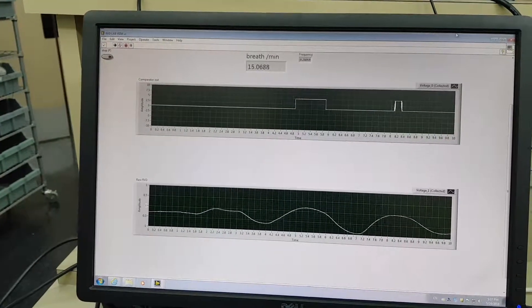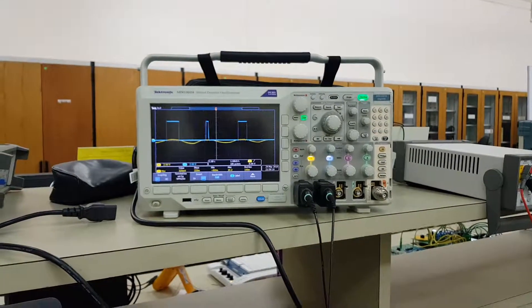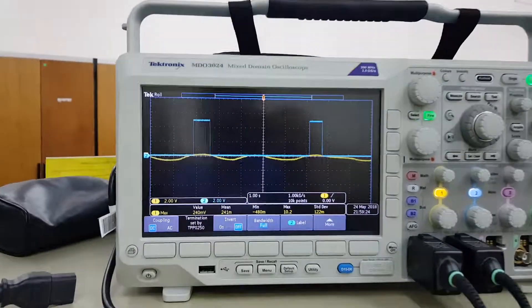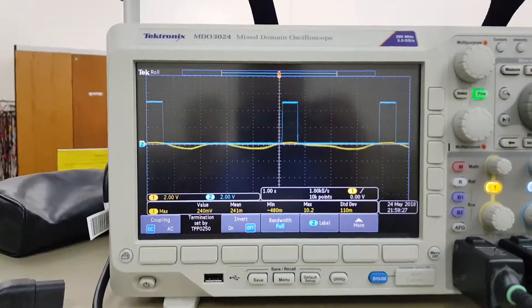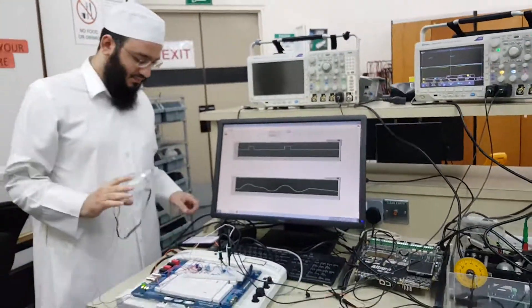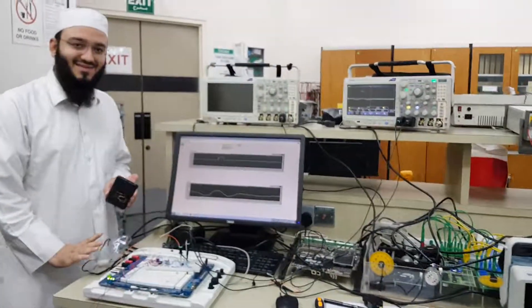The reading is 14 breaths per minute, and the oscilloscope also confirms this. Thank you, doctor. This is our project.